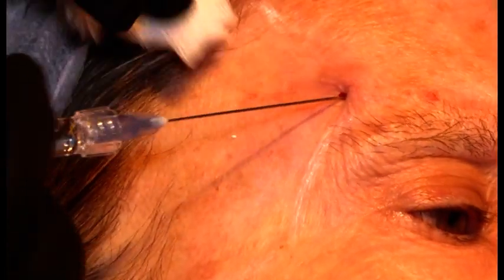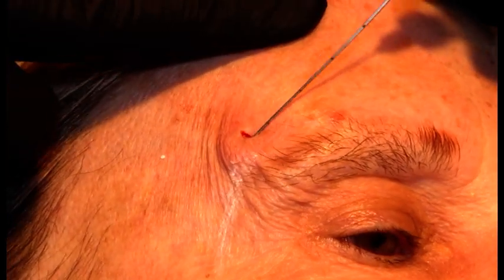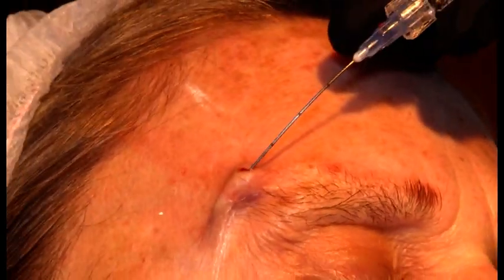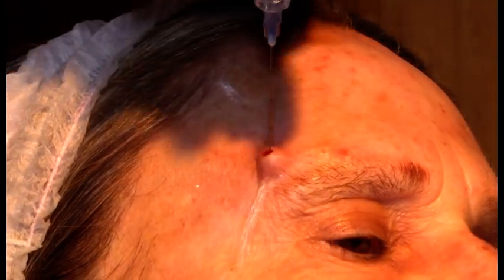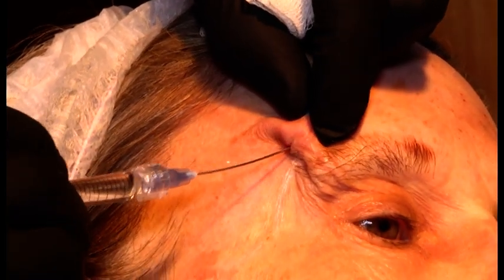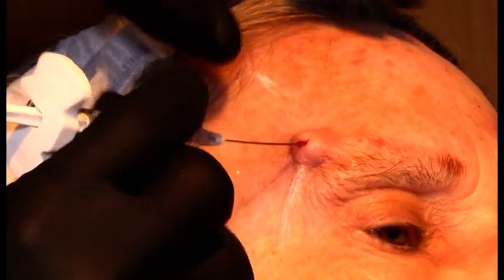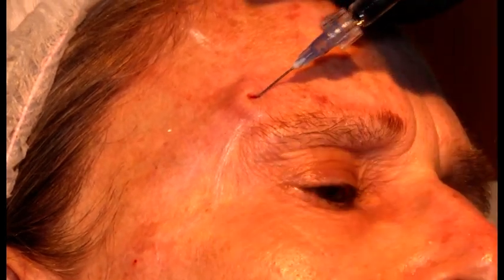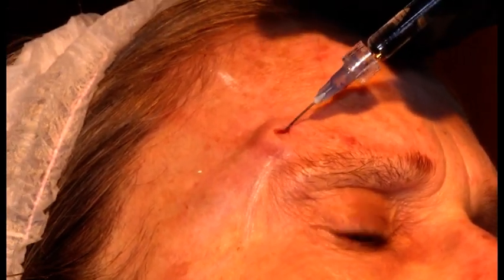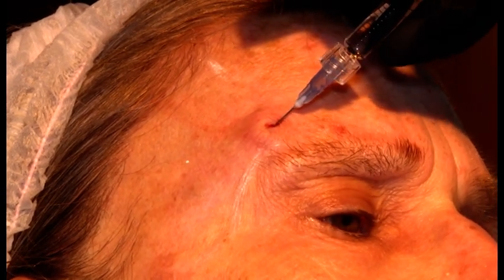I put the cannula in the subcutaneous layer, and I will show you what it looks like if I keep it subcutaneous. It looks like this. But if I first take it through the galea, I'm on periosteum, and then turn it around, it looks much different. Do you see the difference when I try to pull it up? So now I know I'm in between the two fascias.